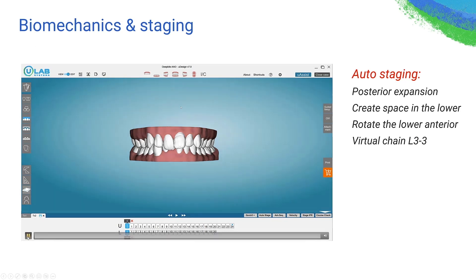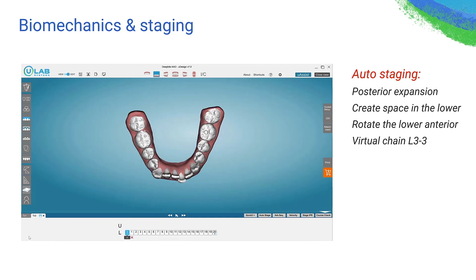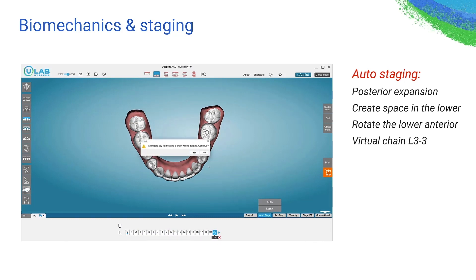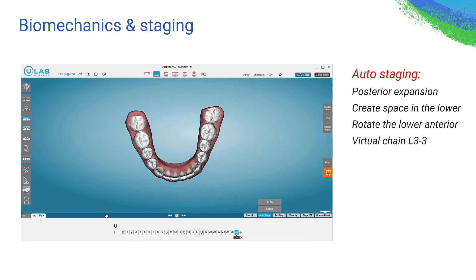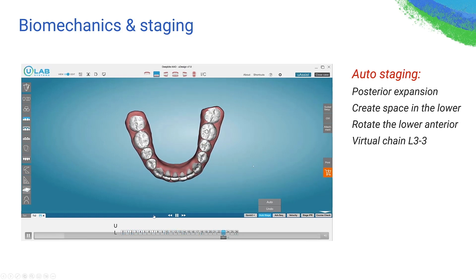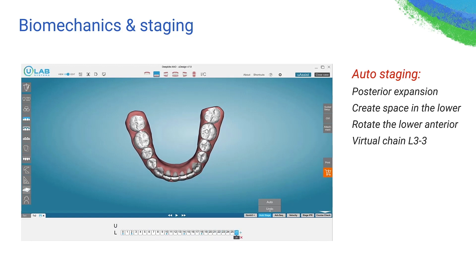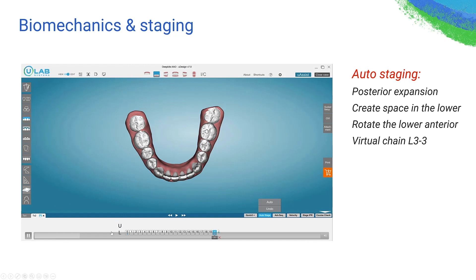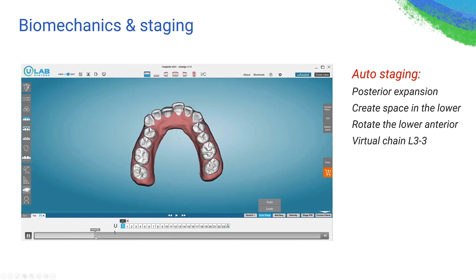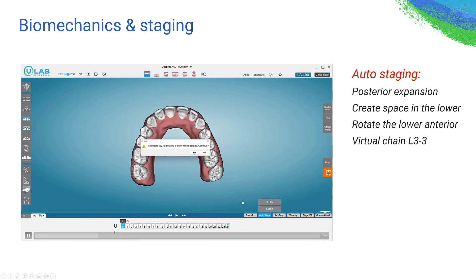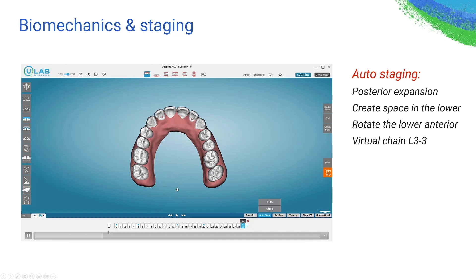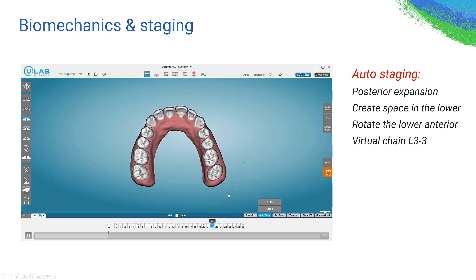Here are two biomechanics approaches you can use. One is auto staging — you click on auto staging and it creates all the stages. Auto staging is really good for managing potential collision during the course of treatment, but it doesn't build a lot of complicated biomechanics. You can use it for crowding cases — basically it expands the posterior first, lines the teeth up, then brings everything back. However, the auto staging creates en masse retraction. If you don't want en masse retraction, you can use advanced sequencing instead.